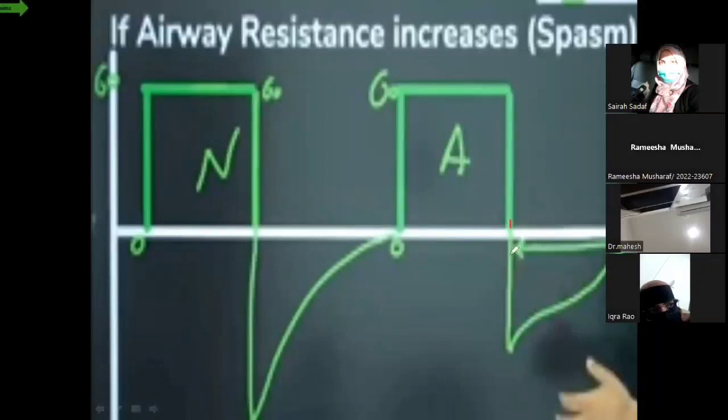So what happened here? This limb will be shorter, and it will take more time than normal to fully exhale or fully empty the lung. Okay? This will be shorter, and this will be longer.